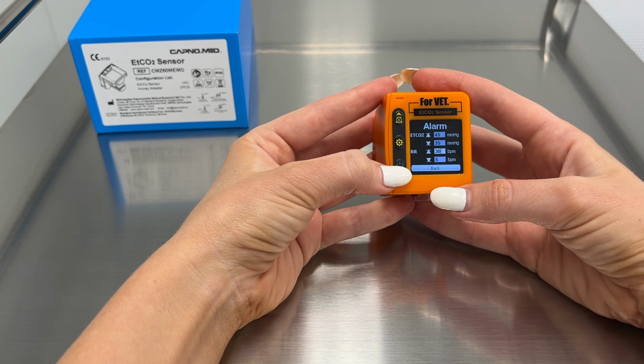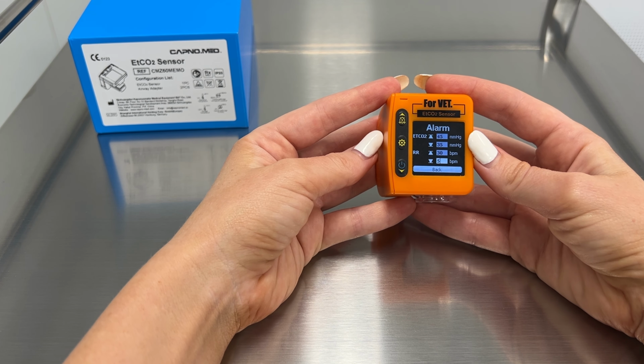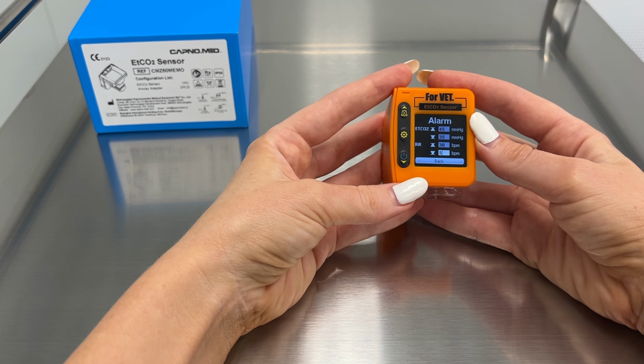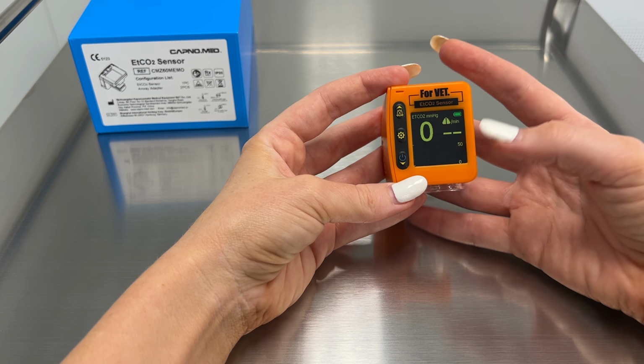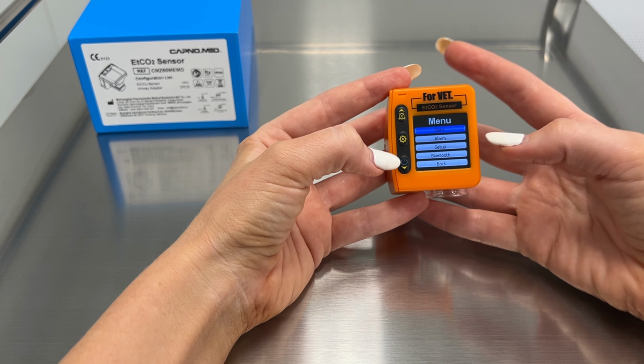And now I want to go and just increase that 5. Because it's going to be an anesthetized patient, their respiratory rate might be a little bit delayed, but I still want it to notify me if it is getting quite low. Oops, timed out. So when it does time out, it will just go back to the menu.